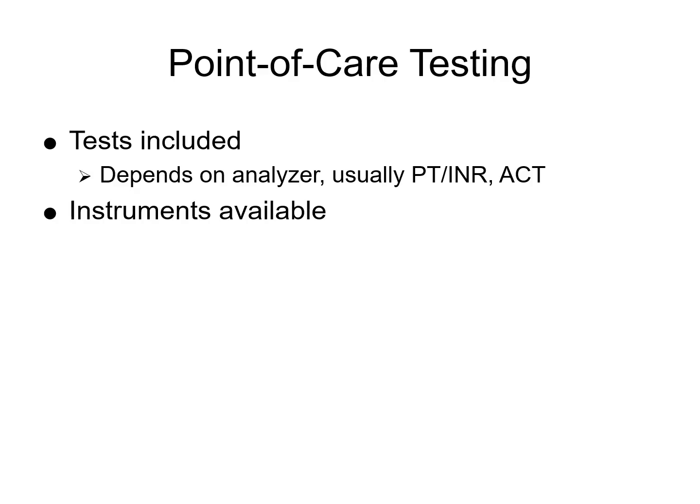There's also an Abbott Afinion AS100, which includes some coagulation assays as well. So laboratory-based automated and semi-automated analyzers, they're not strictly point-of-care, but sometimes they're integrated in decentralized testing. These can include certain things like a Stago or a Siemens BCS series. You'll probably see a Beckman Coulter and a Sysmex as well.